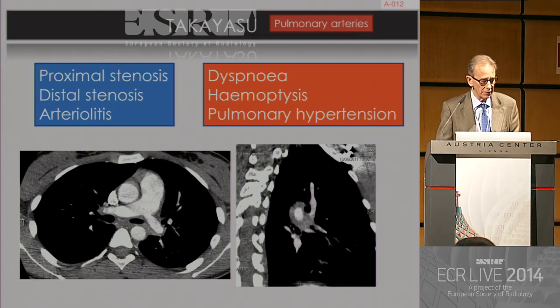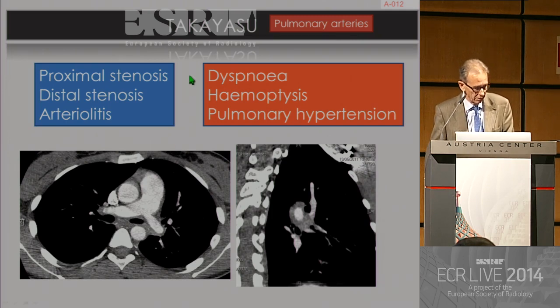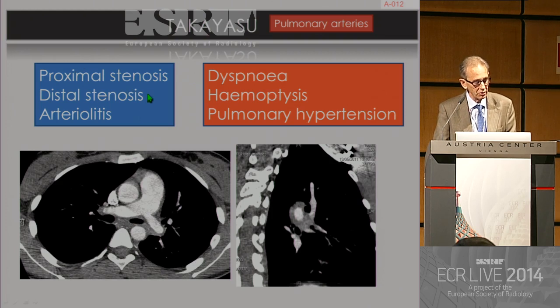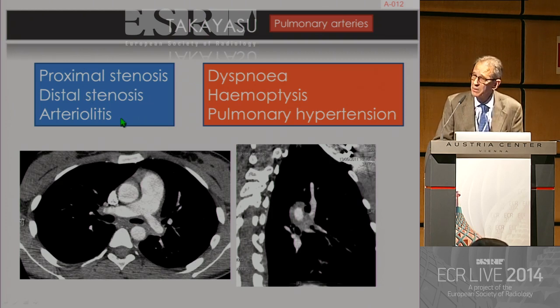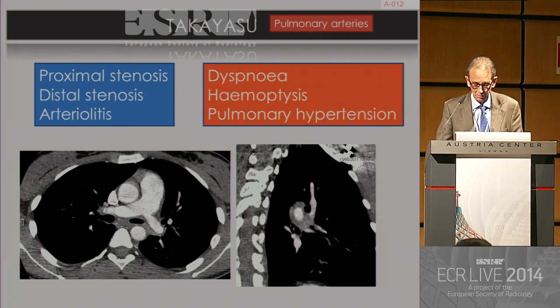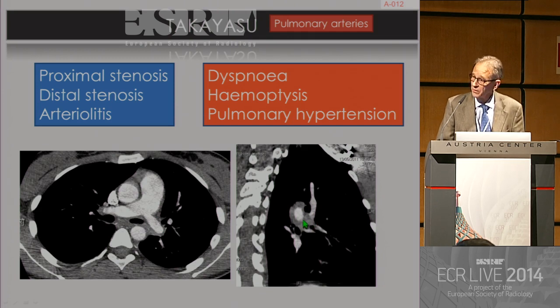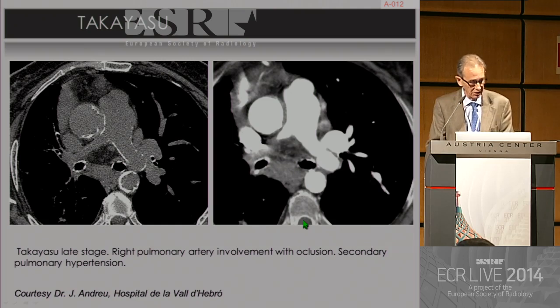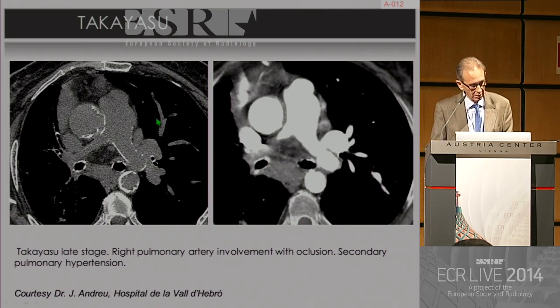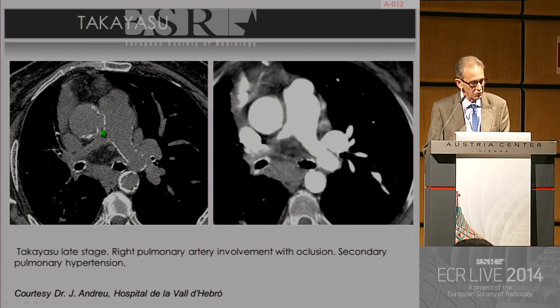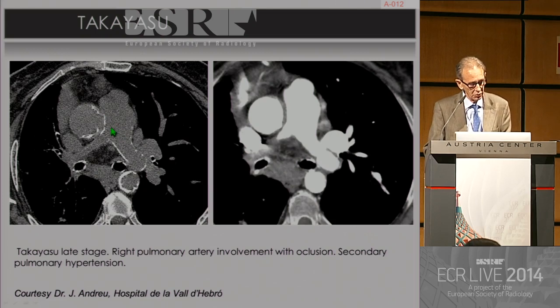The pulmonary arteries may be involved in Takayasu in around 10–15% of cases, up to 20% in some series. Usually you will see proximal stenosis, distal stenosis, and there may also be an arteriolitis in the peripheral lung that can produce mosaic pattern. This case shows the left pulmonary artery stenosed. Look at the mediastinal fat and the sagittal view showing the thickening of the wall of the pulmonary artery. The late phase of Takayasu also shows stenosis in the pulmonary arteries and calcification in the walls due to intimal changes.